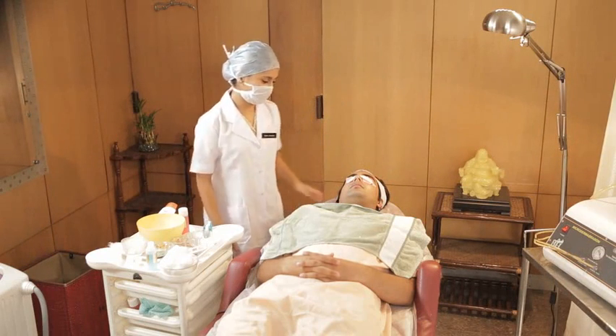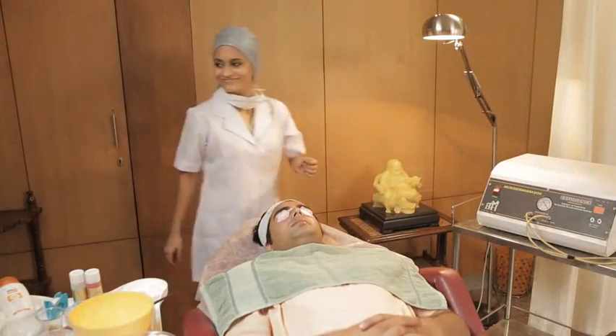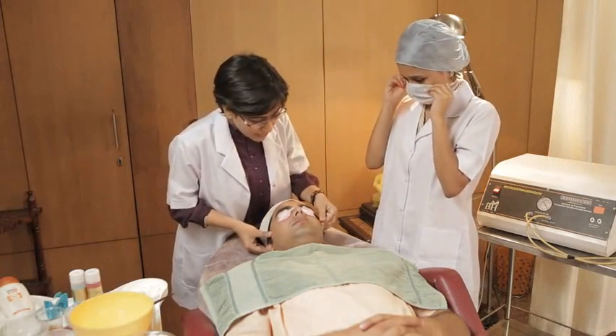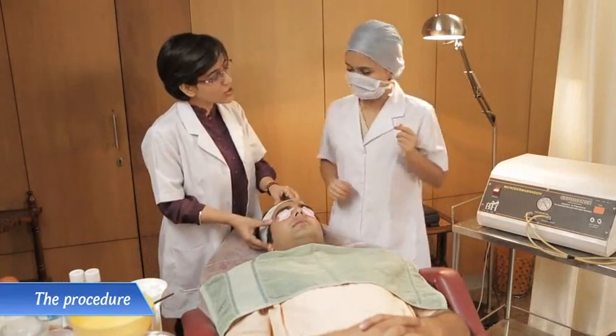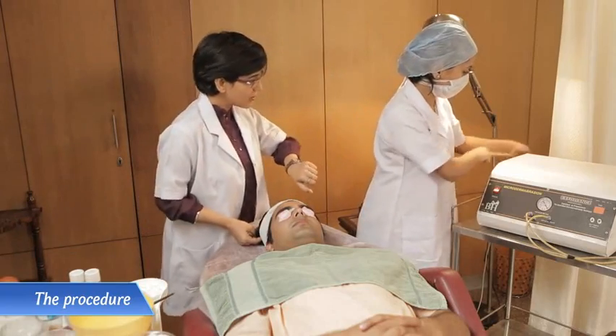I'll just go and inform my senior professional that we are ready to start. Mr. Arun, I can see Kavitha has made you all ready for the second session. Yes, I'm in good hands now. Kavitha, let's switch on the machine and set the timer. Ma'am, what time do you want me to set the timer at? 15 minutes. Okay.